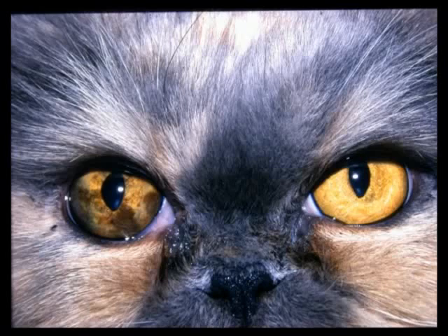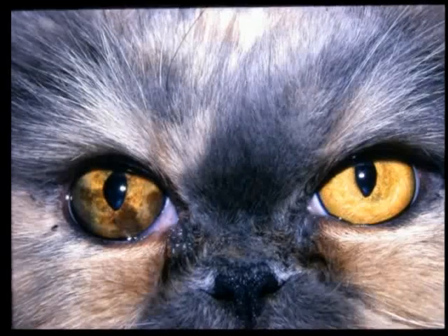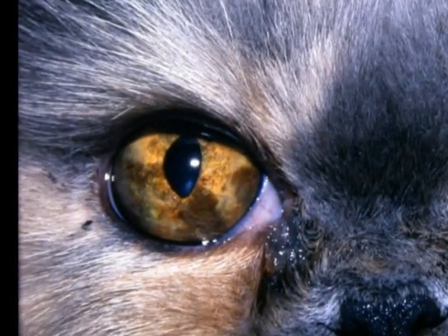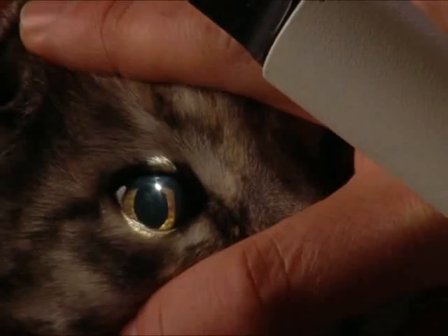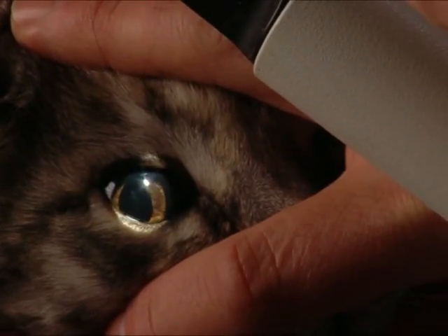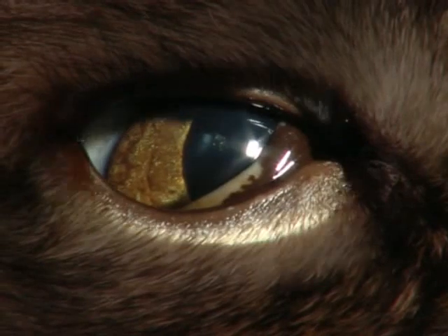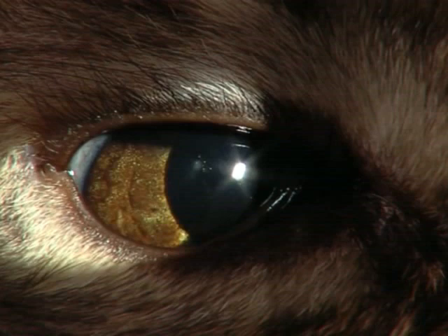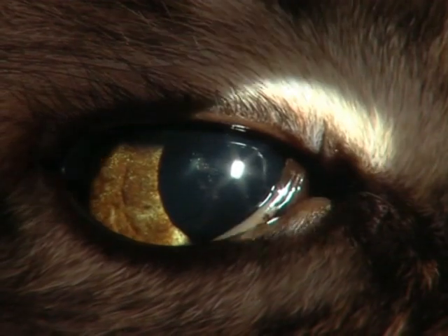In cats, it has a significant rate of metastasis. As the disease progresses, the rate of metastasis increases, so early detection is important. Clinically, iris melanosis can be difficult to distinguish from melanoma, particularly as melanosis can transform into neoplastic disease. Here, some normal iris architecture is still visible, so melanosis is more likely. However, there are some spots in the pupil which may be melanocytes shed from the surface of the iris. This could be an early sign of disease progression.